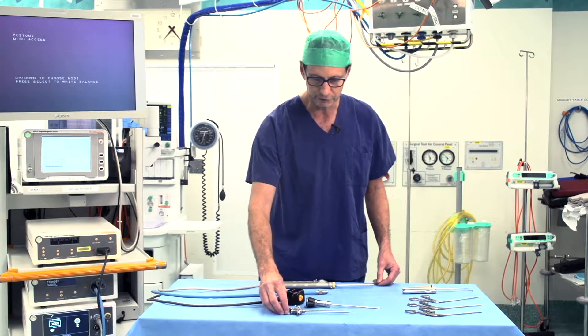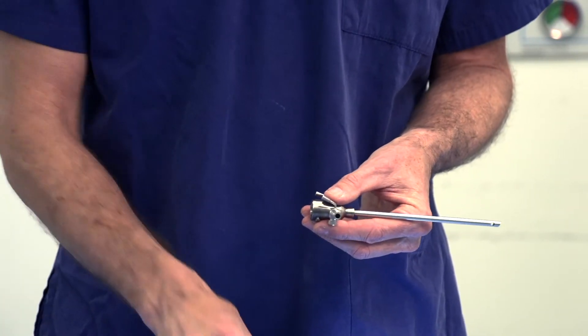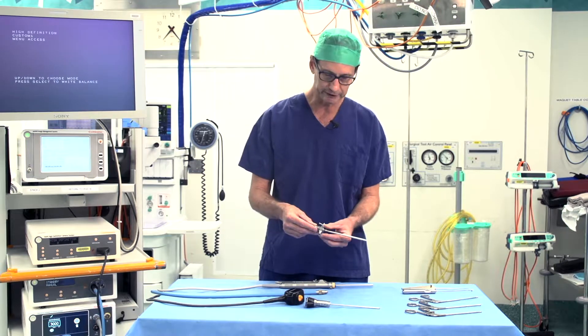This is a tour of the equipment we use in a knee or shoulder arthroscopy. Firstly, we make a cut in the skin and we insert this device, which is a trocar and cannula. This goes through the skin into the joint.